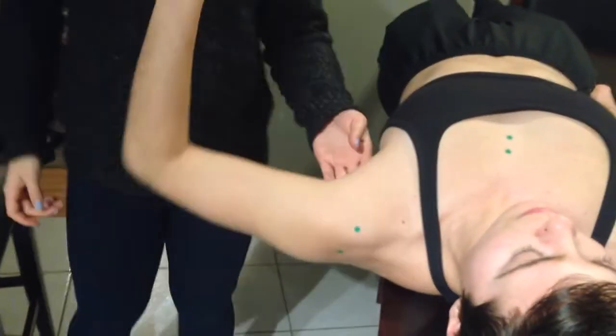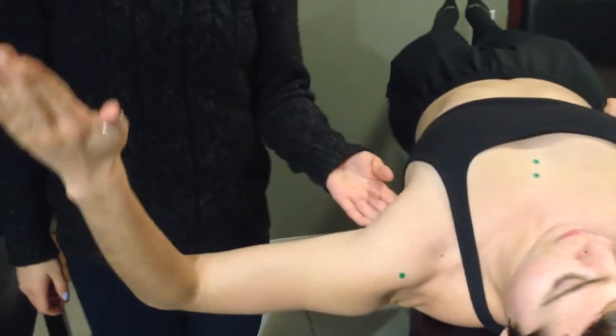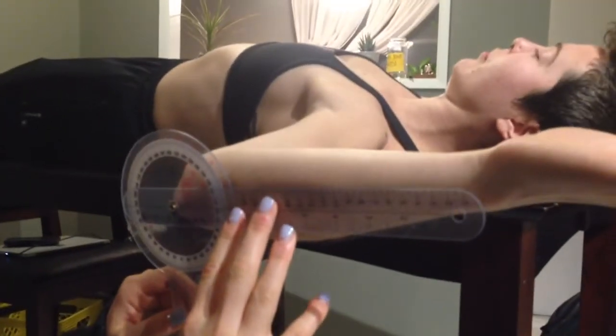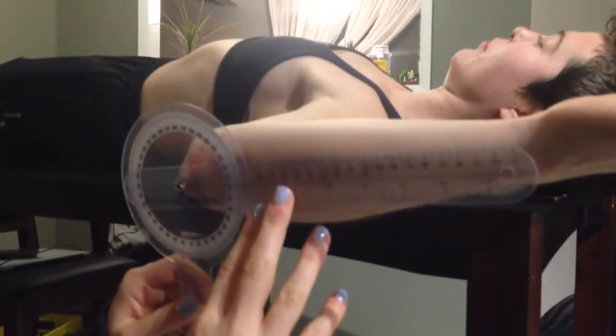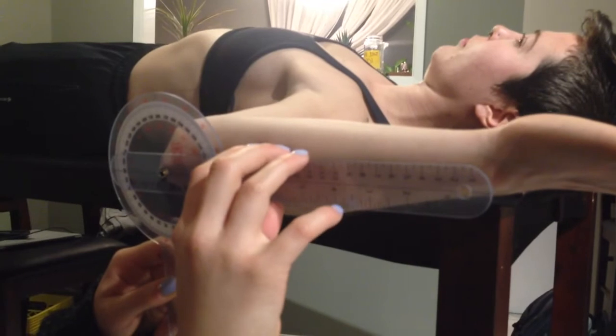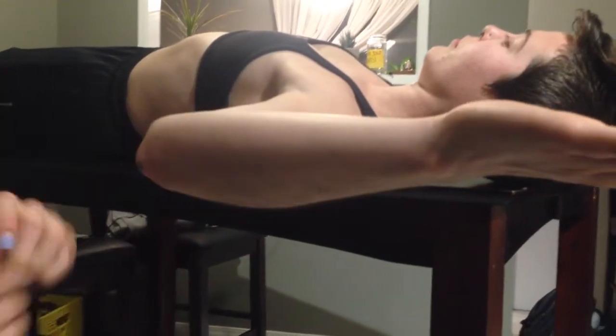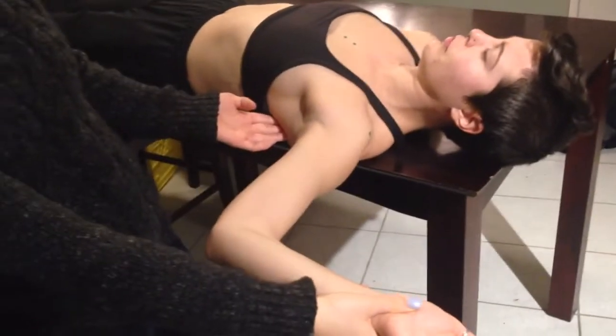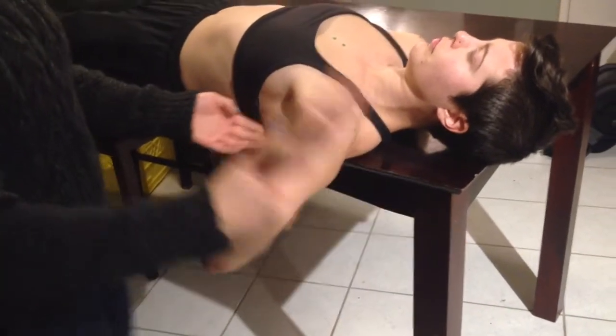Going into external rotation — externally rotate back. Stop, that looks to be about 90. Same line marks as the other side, and this is actually 90. Normal for this is 90 to 100. With passive I get to 90 as well with an open-end feel.